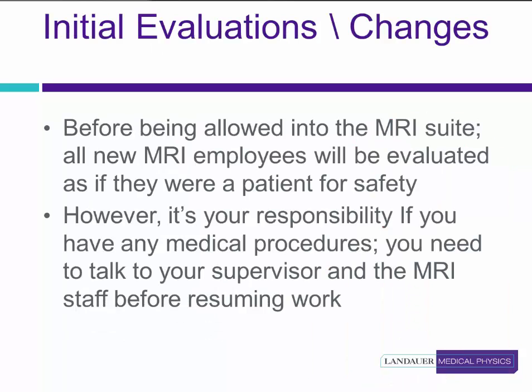Just because you're not the patient doesn't mean you're out of the woods. The magnet is always on. Even if you're going into the magnet room and there hasn't been a patient on the table for 12 hours, the magnetic field is operating at the same strength and has the same risks. As a new employee in the MRI area, you might be required to undergo a screening evaluation to determine if you're able to go into that environment. Once completed, you'll be qualified to enter the magnet room.